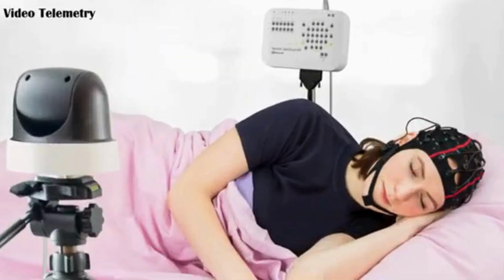Video telemetry is another type of electroencephalogram. It is a special type of EEG where the patient is filmed while the recording is taken. This test provides more information about brain activity. It is usually carried out over a few days while staying in a purpose-built hospital suite.